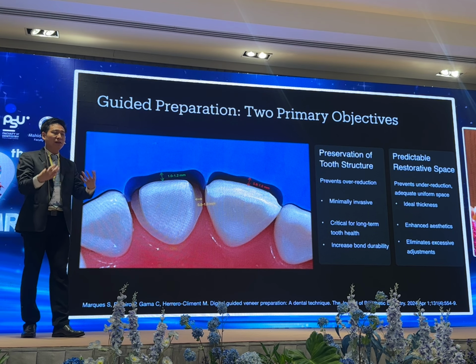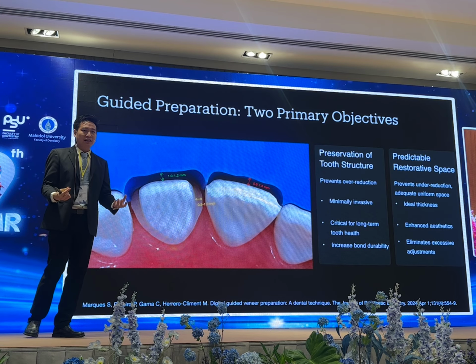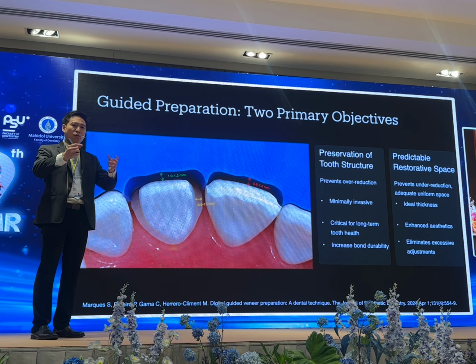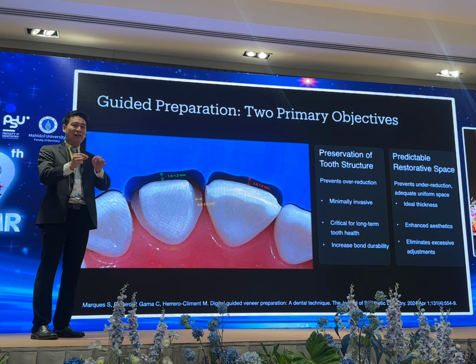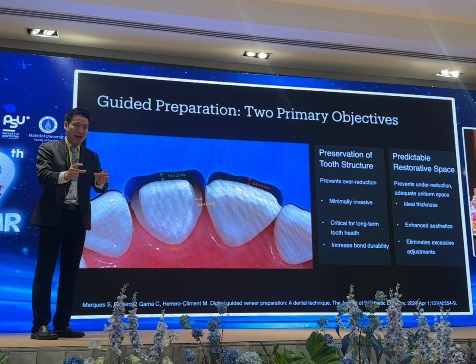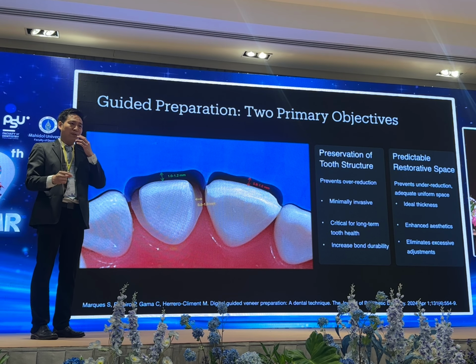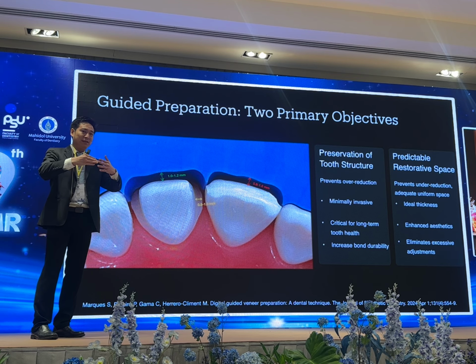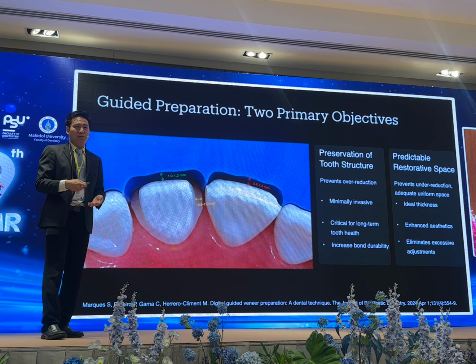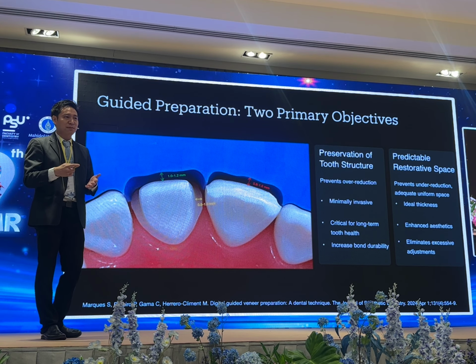And you put the putty into the patient's mouth, and most of the time you will wonder, how do I know that it sits properly? It's not like a wobble, because putty is not solid. It still has some flexibility. If you put it a little too harshly, put too much on the lip of the patient, sometimes it distorts. So it is kind of unreliable. It's just like some index for you.